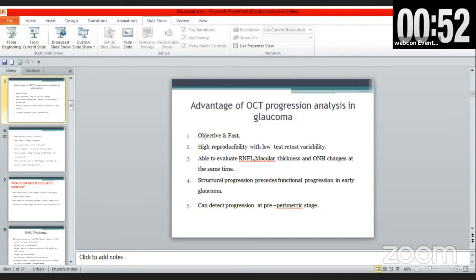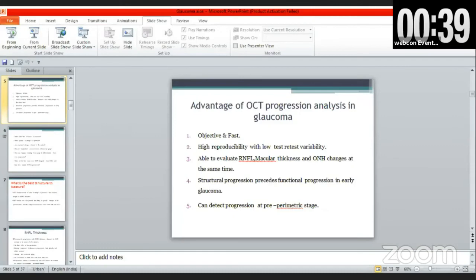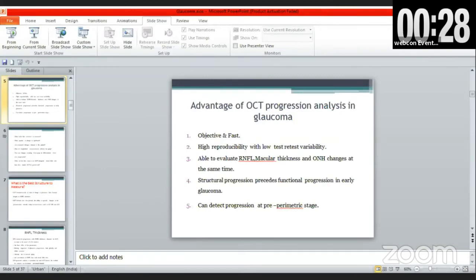In the left eye, two areas show outside normal limits and one yellow zone indicates borderline. This is a FORUM output from the Spectralis OCT with the Heidelberg perimeter: the patient has a defect in the inferior nasal quadrant, and the OCT has flagged the superotemporal quadrant in yellow, showing corresponding thinning.